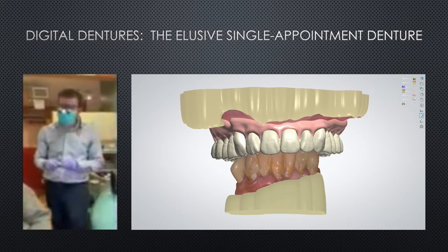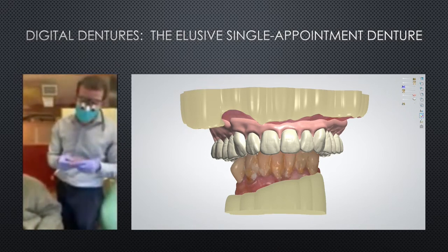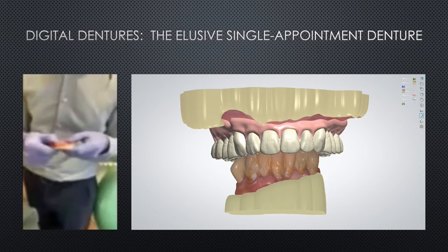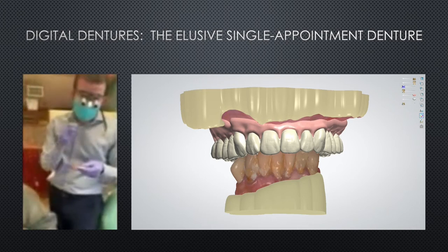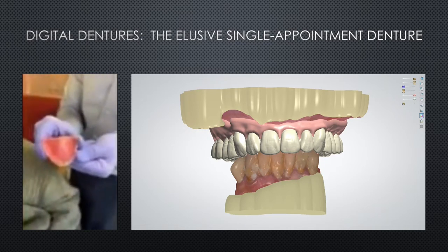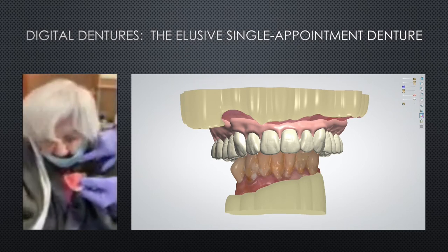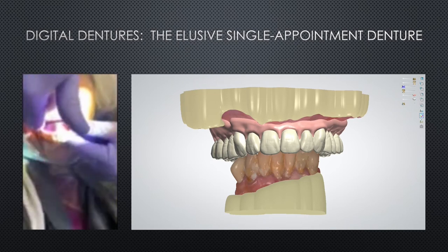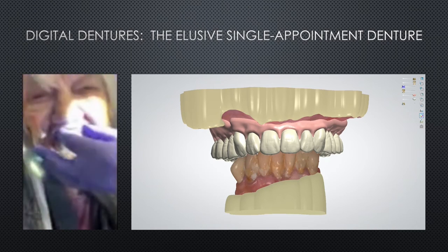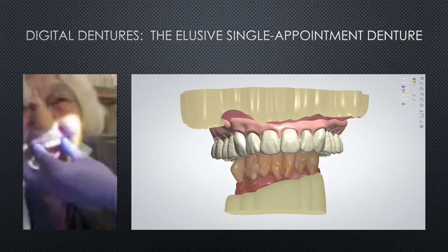Hey, Minh Tran here. Just wanted to show you the denture that we did for Alice Meyerhofer here. We scanned this one a couple weeks ago, and then I just took a bite with some base plate wax, but here's the fit. You wouldn't think that it would be very retentive just with the short borders, but check this out. Okay, let's see, Alice. I'm just going to seat it again here. And I'm just going to fire it in there. And as soon as it goes in, you can open there. It is in there tight, which is pretty crazy.